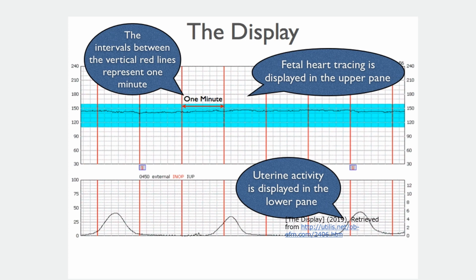Now, when you do this, the way we document it is you want to make sure that you're in there so when she starts a contraction, you can measure. Okay, if you feel like the tip of your nose, that's a mild contraction. If you feel your chin, that's a moderate, and your forehead is firm. And that's exactly how you're going to document in the medical record when you have an external. And you want to be making sure that you're palpating her contractions.